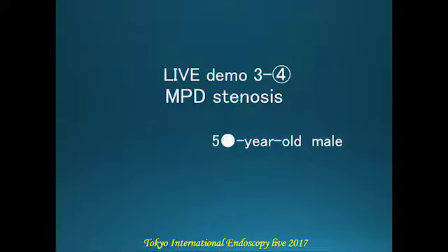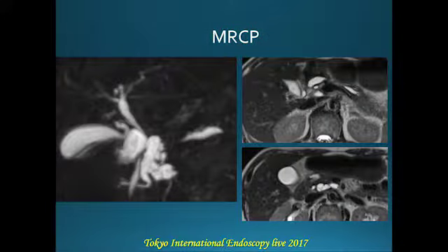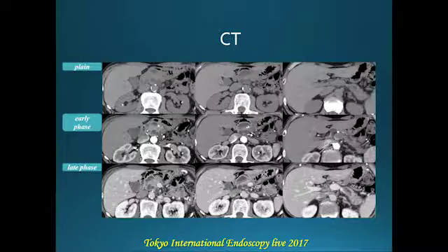The next case is a 50-year-old man with pancreatic duct stenosis. The patient has a history of recurrent acute pancreatitis. CT scan shows main pancreatic duct stenosis. Scheduled for further workup with EUS and possible FNA. Dr. Stefan Seewald in the endoscopy room.